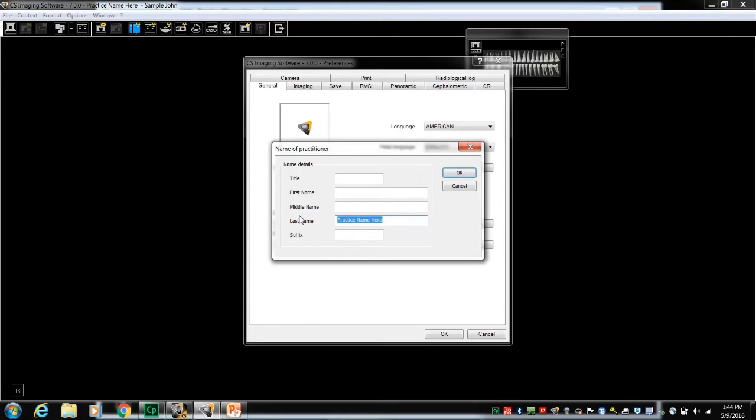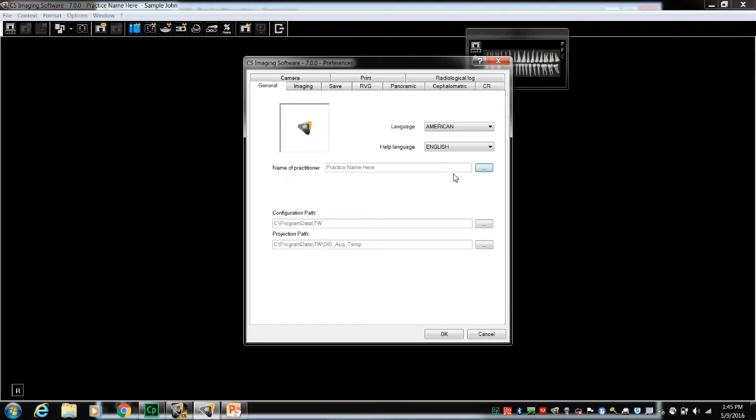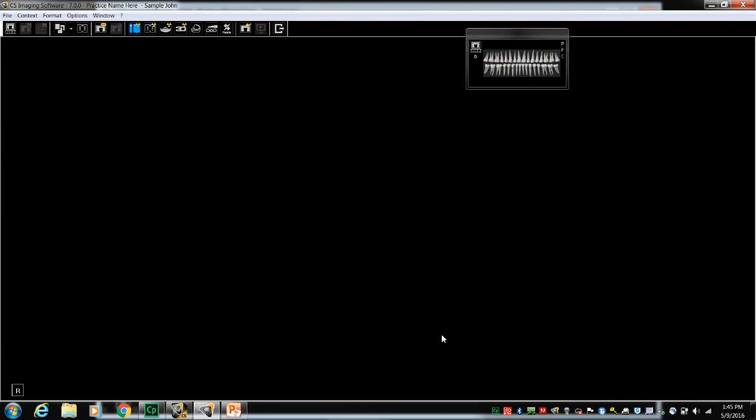Select OK to close that window and save the changes, and OK to close the Preferences window. For more detail on Preferences, refer to the recording about Software Preferences.